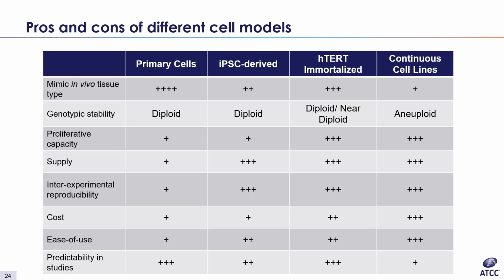The third cell type is an induced pluripotent stem cell derived primary cell, or iPSC-derived primary cell. This cell type is derived from a somatic cell line that is dedifferentiated to an embryonic state and then differentiated to a specific primary cell lineage using a specific cocktail of growth factors. iPSC-derived primary cells are usually generated from a single clone, so there's likely little worry regarding the introduction of biological variability. The main problem with stem cell-derived cells is that they are differentiated into immature primary cell types, so not the best for predictability or biological relevance.